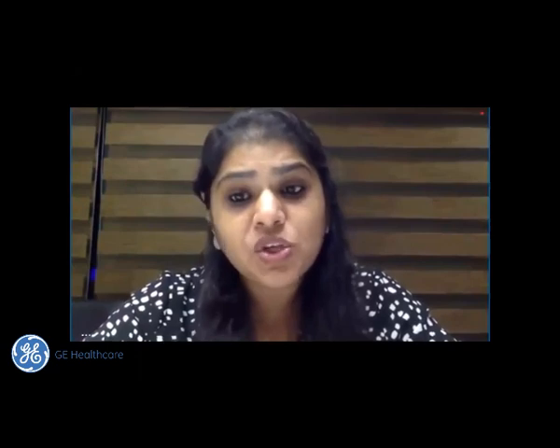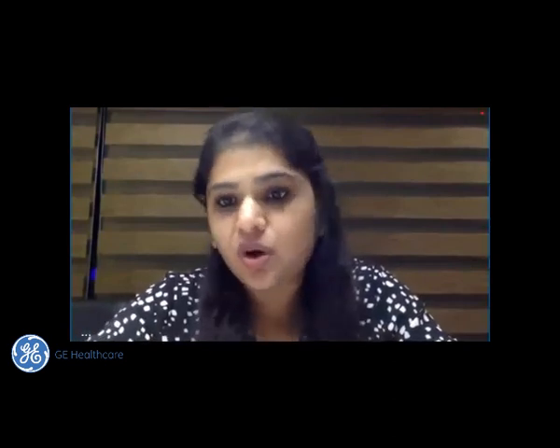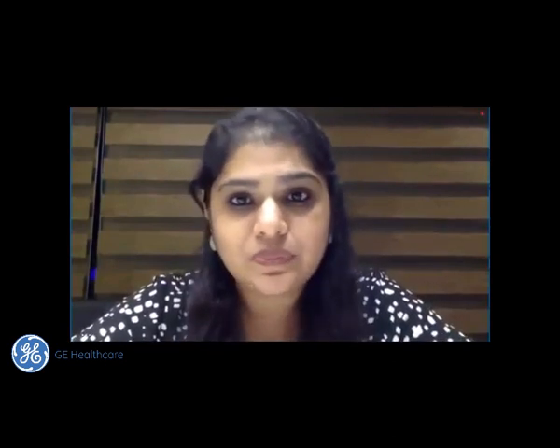Okay, and why should we not date such pregnancies by CRL? Although CRL is the best mode to date a pregnancy in an otherwise situation, in IVF we are very sure of when the conception has happened, and that's the best way to date a pregnancy. So we should not go by the suboptimal ways. Which means that if we go to CRLs again in the 12-week scan and suppose there's some discrepancy, we will miss out. We'll red flag the patients.